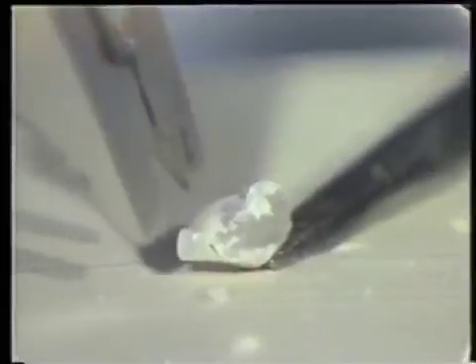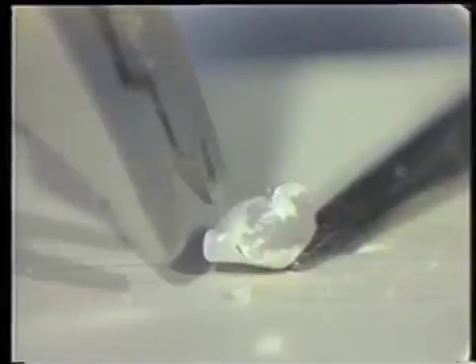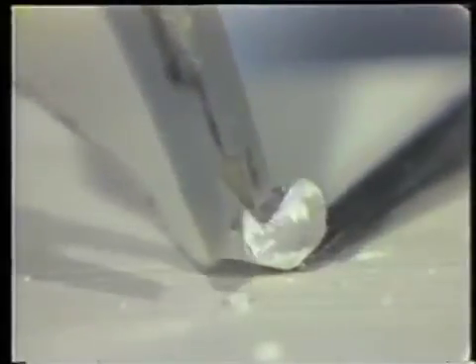You'll notice that the porcelain that did fracture has not fractured cleanly off of the metal. There's not a shiny metal underneath, but there is an interface of glass remaining on this porcelain crown.